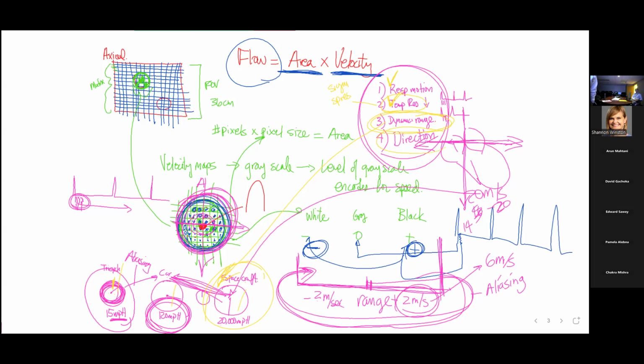And then lastly, we've got to set the direction. Okay? If it's going to be in plane, which direction, depending upon the jet that you want to look at, or is it going to be through plane? Now, one thing we didn't mention, how many pixels do you need in the lumen to actually measure the blood flow accurately? Does anybody know? 16. So when you're setting your spatial resolution, depending on the target, you need at least 16 of these blocks in order to make an accurate velocity measurement when you're doing flow in these blood vessels.